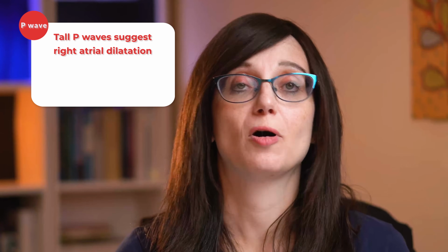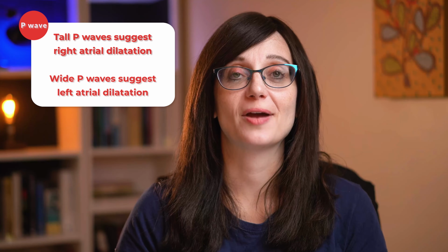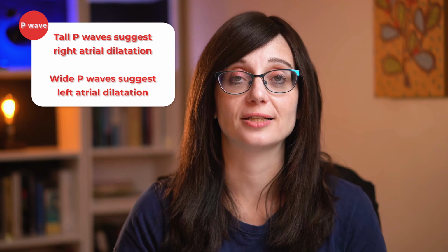Tall P waves are called P pulmonale and suggest right atrial dilatation, and bifid and wide P waves suggest P mitrale, which is left atrial dilatation. So what we've seen is that most of the criteria here for normal sinus rhythm are about the P wave, but remember the rate is in there too. So if you've got normal P wave elements that we've talked about, and you've got a rate that's very fast, then what you've got there is sinus tachycardia.